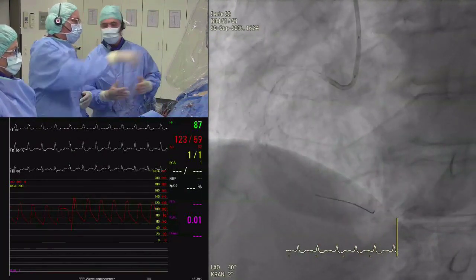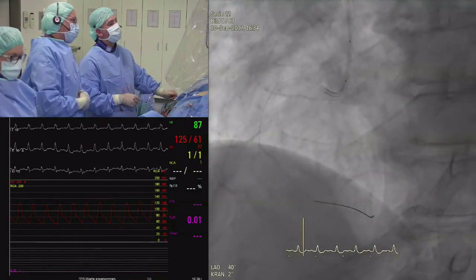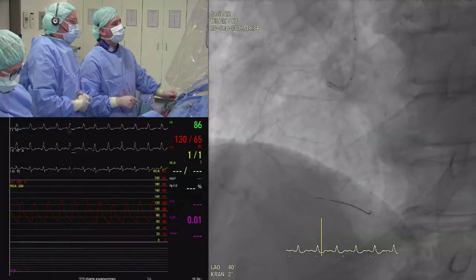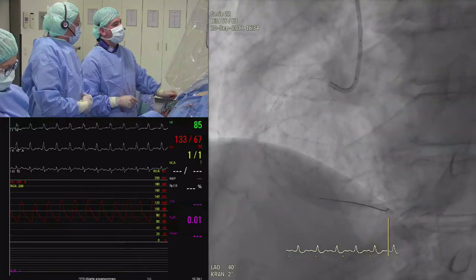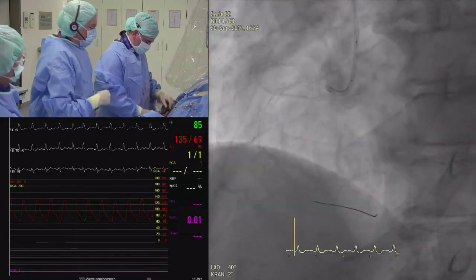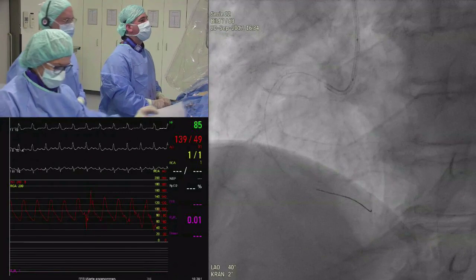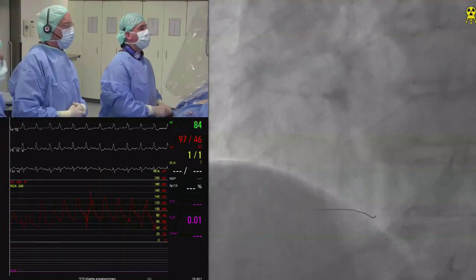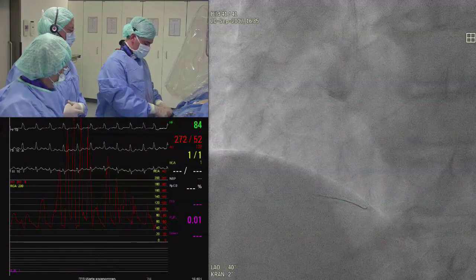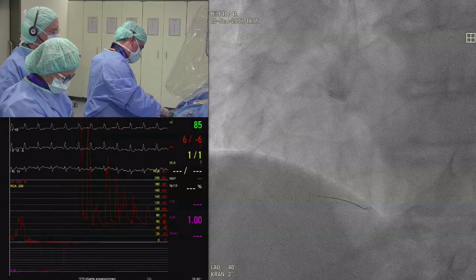What do you think? Looks good. It's, you know, right at the bend, we were expecting to have a little dent in it, which is what it's got. I think if the physiology still looks good, we're good, right? What does the panel think? Kind of quiet. You guys getting tired? So we had a discussion about the length, and when I would say the stent was being deployed, we get the feeling that maybe 2 millimeters more would have been perfect, but at the end of the day, physiology will decide.